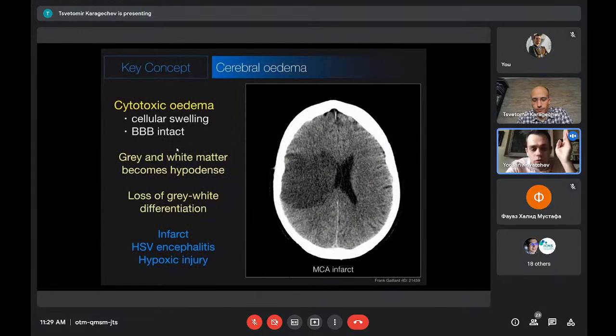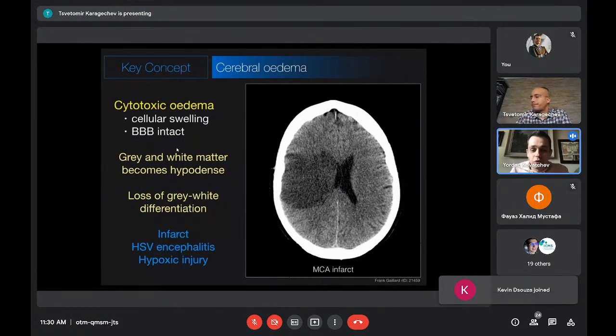Before I show you the vessels and the different lobes of the brain, which is an important part of our talk, there are two take-home messages from my part of the presentation. Even if you don't listen to anything else I say and you don't remember anything else, just try to remember these two things, because, as we said in the beginning, when we look at CT, these are the things that we try to notice first, if they're present or not.